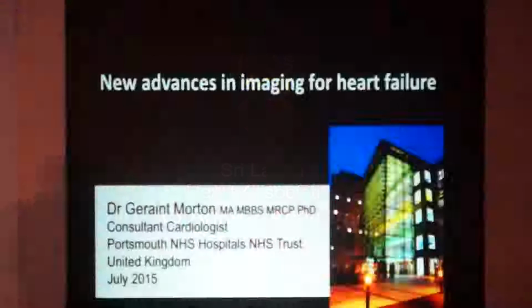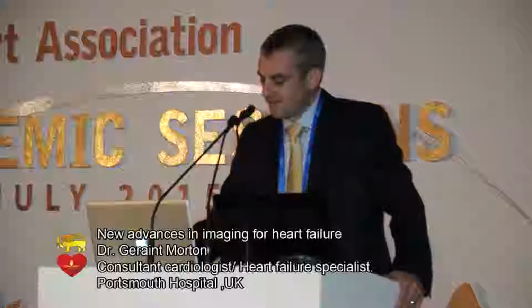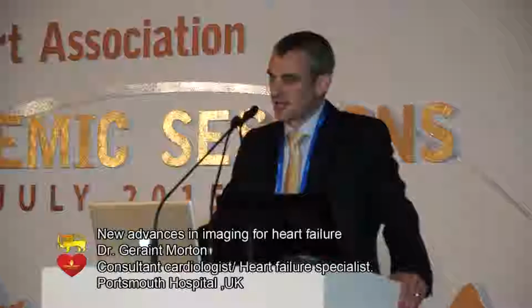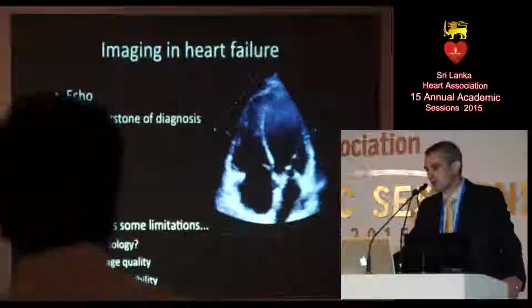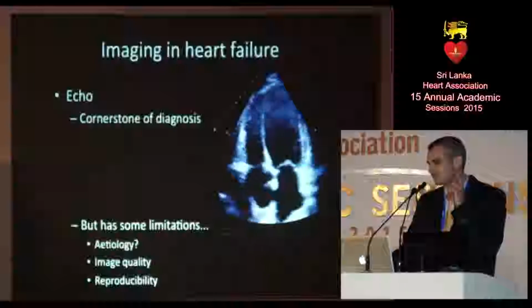So I'm going to preface everything I say in this talk by saying that echo is, of course, central to imaging in heart failure, the cornerstone of imaging and diagnosis. However, it does have some limitations, sometimes image quality, sometimes reproducibility, and somewhat limited information about the etiology of heart failure.